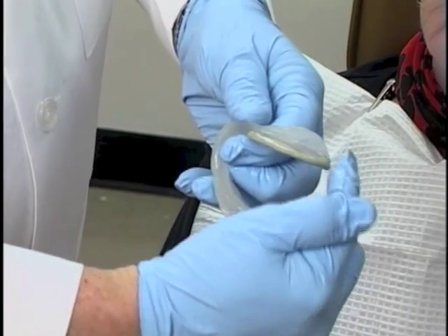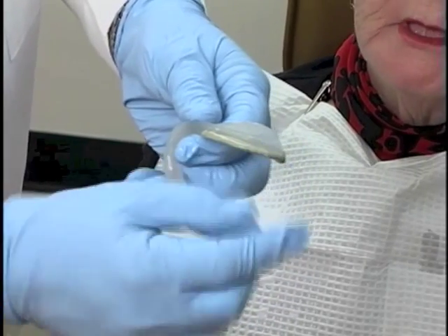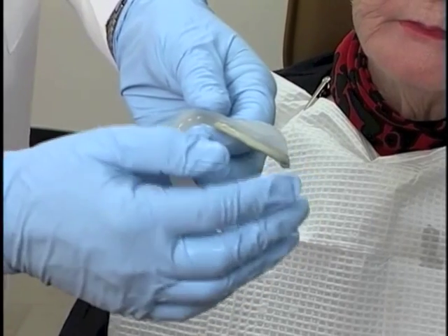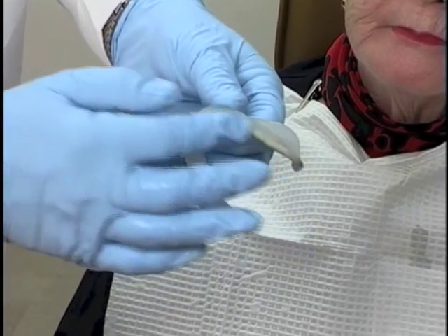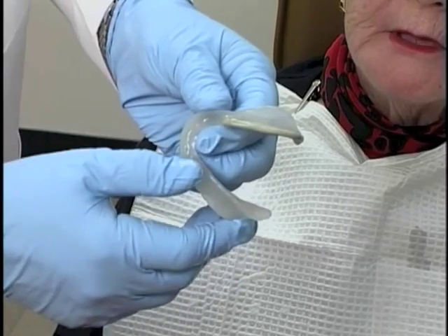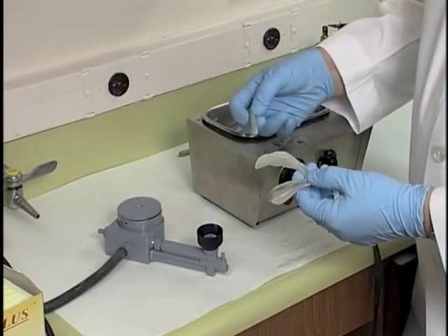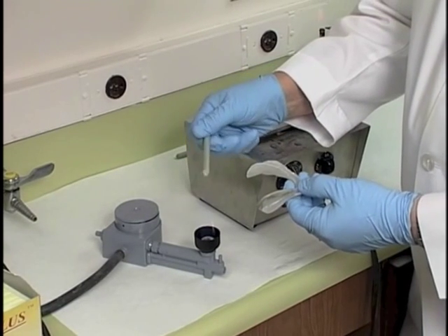from the retromolar pad down the retromolar curtain area into the post-mylohyoid space, or retromylohyoid space area, and up through to about the second premolar on that side. To do the opposite side now on the distal lingual, we're going to do exactly the same thing.